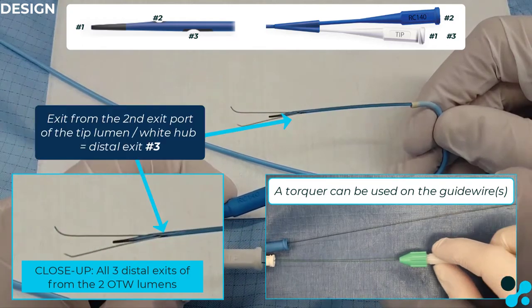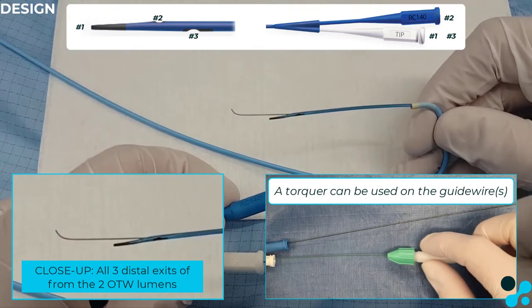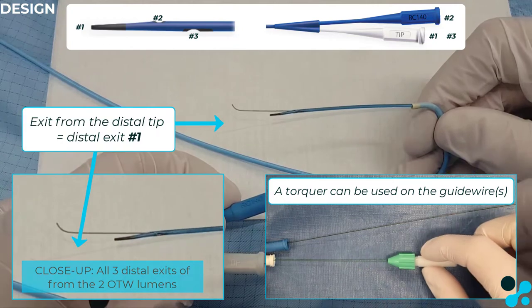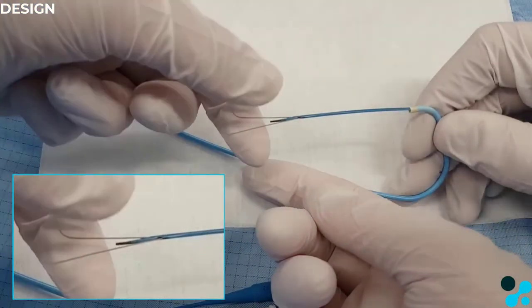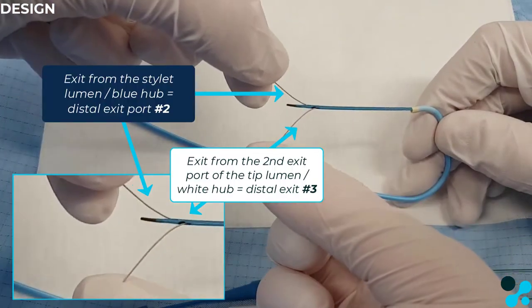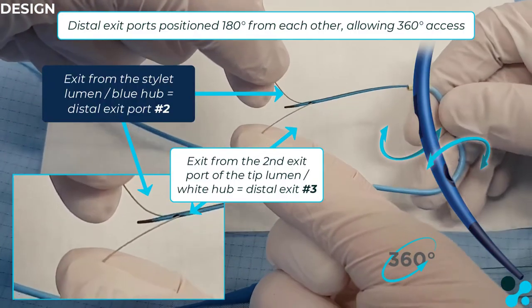A torque can be used on both of the guide wires in order to rotate them more easily. Both exit ports are positioned 180 degrees opposite to each other, allowing almost 360 degree access.